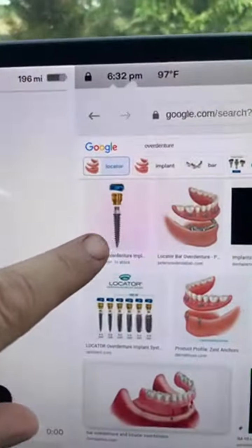The inserts, or that connection to the actual locator, are going to get worn out really quickly, and the denture is at risk of breaking, because it's basically stilettos on glass. This is one of the things people don't like: they have to switch out those inserts often. On top of it, if their bone starts to change, they have to have what we call relines, where we add material into the device. I did this just today with one of my patients, and you're looking at $500 to $1,000 just for a reline to add that space in.